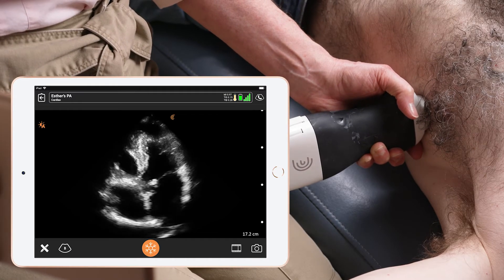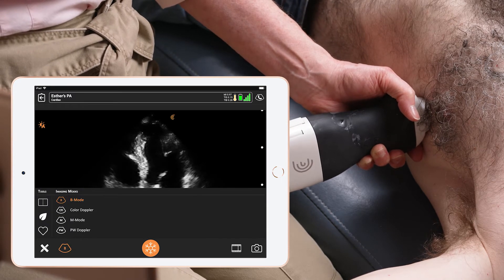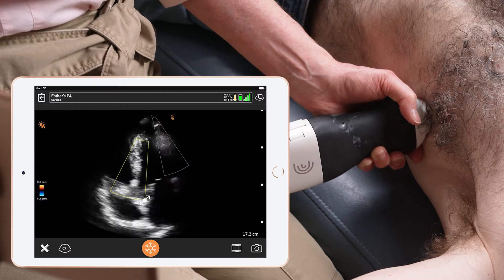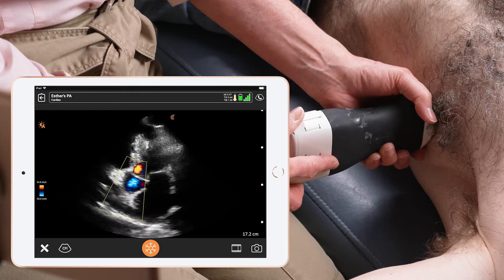I'm going to start with the tricuspid valve. I select the mode icon and I select color Doppler. I press the box and I move it down to the tricuspid valve.